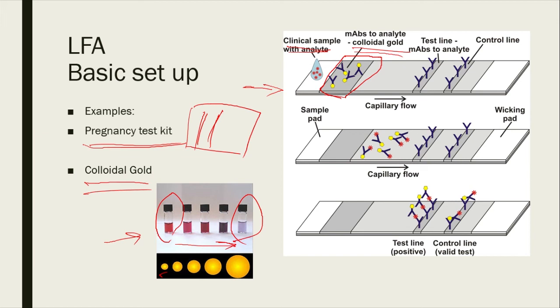Now here I boxed off an antibody conjugated to colloidal gold. This antibody is specific for the analyte. So for example, if it's a toxin B, it would be toxin B specific antibody that are linked to this gold color. So that means these antibodies would be red visually, pinkish red, because of the gold nanoparticle.